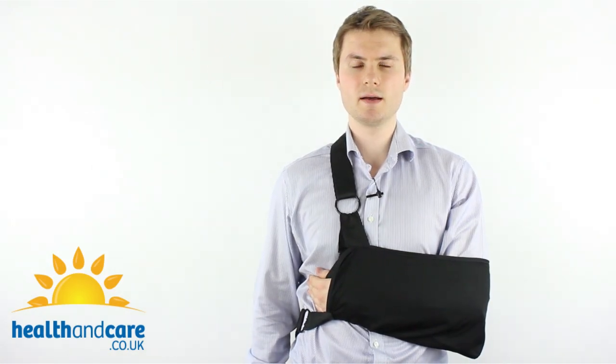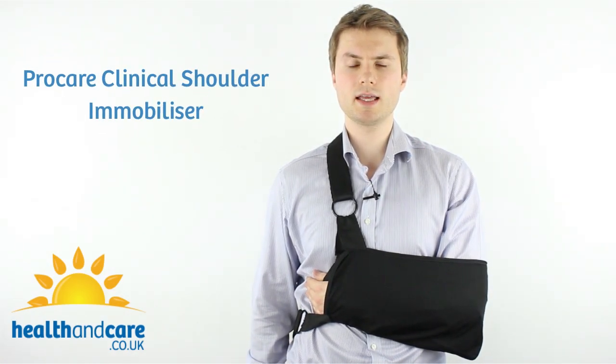Welcome to Health and Care. My name is Paul and today I'm talking about the ProCare Clinical Shoulder Immobiliser.